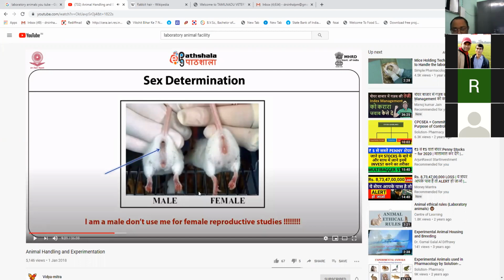Are you getting the point here? How can you differentiate male and female? Hello? Yes, sir. Tell me, how?